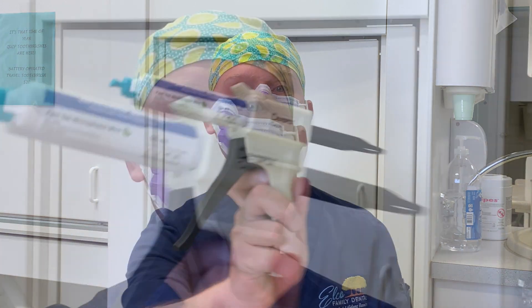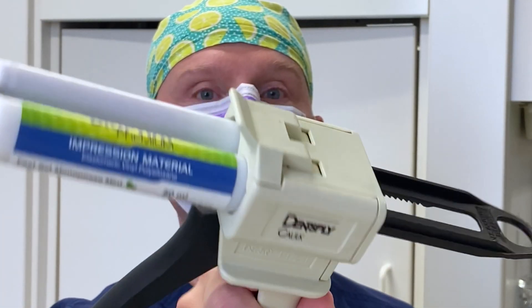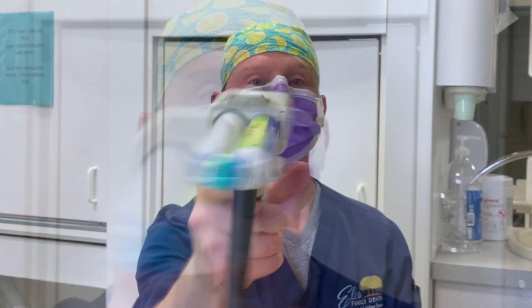I'm going to demonstrate on myself. We'll be using a material you may or may not be familiar with — it's the polyvinyl siloxane, Blueprint in this case. I'll give you a self demonstration so you can better understand what a triple tray impression is like and what you need to do if you're having one.